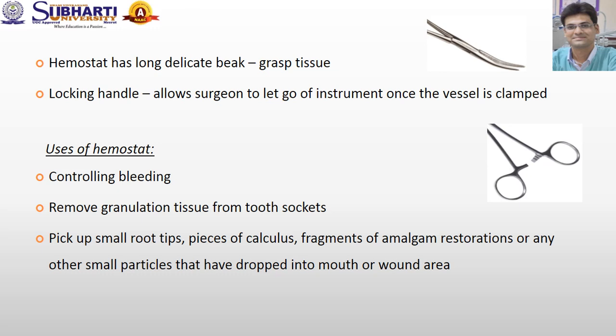The locking handle mechanism of this instrument allows the surgeon to let go of the instrument once the vessel is clamped, or it is held by the assistant. Once the vessel is clamped with the hemostat, the surgeon either sutures the vessel or cauterizes it.